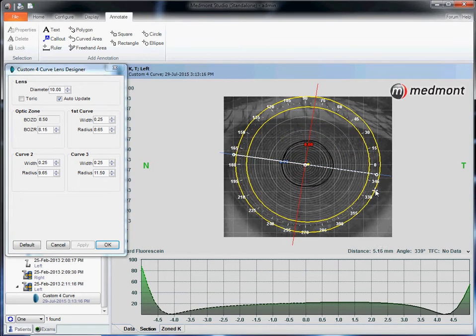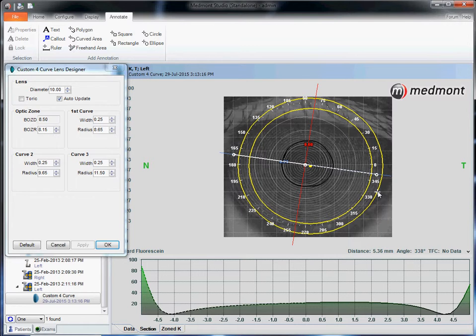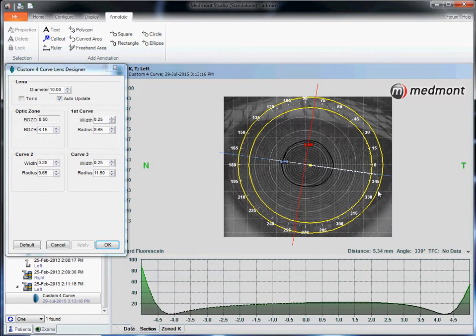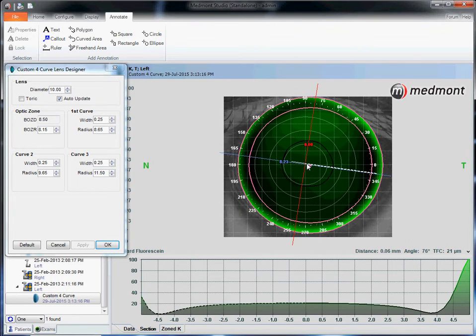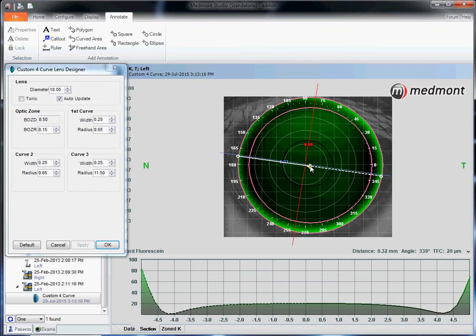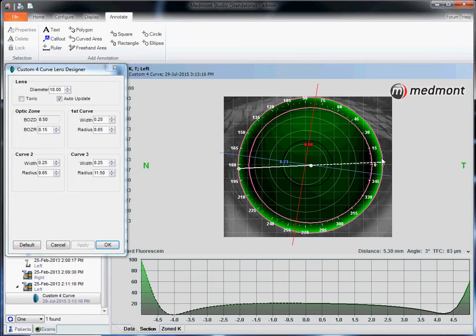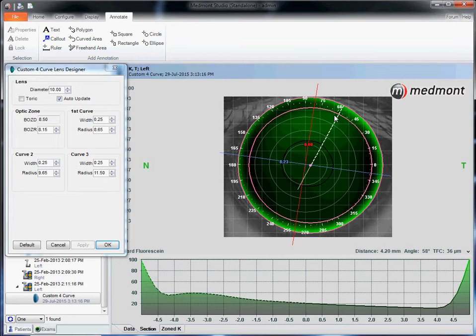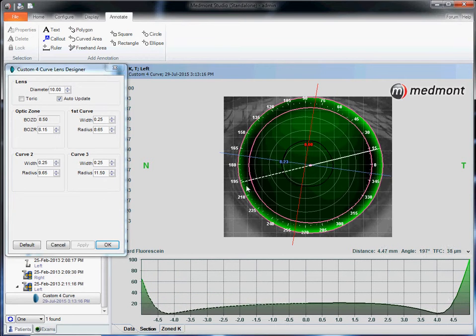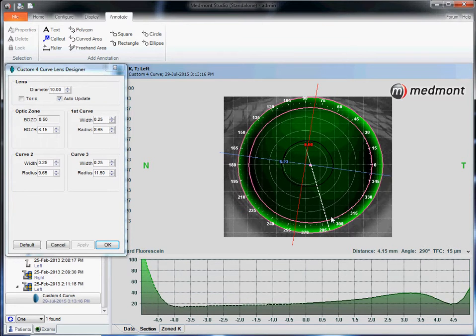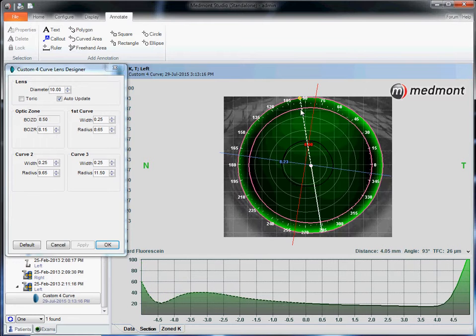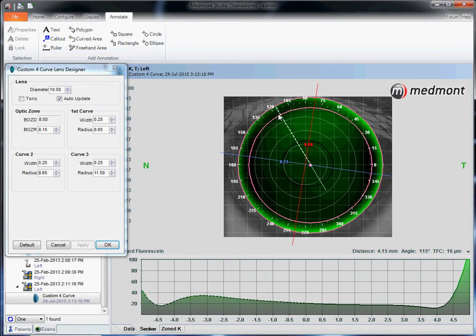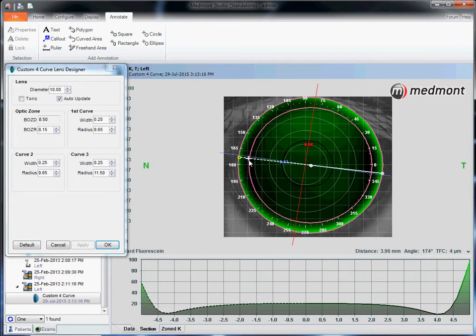We should move the lens to the geometric center of the eye where we would like to see it centering, as if we were looking at this lens through the slit lamp. Next, let's take this white axis line around by grabbing the little handle at the end, holding it down and rotating it. We can observe the fluid layer underneath the contact lens.